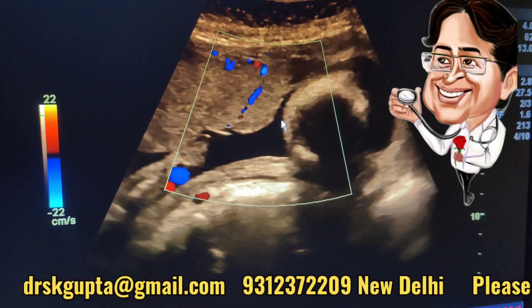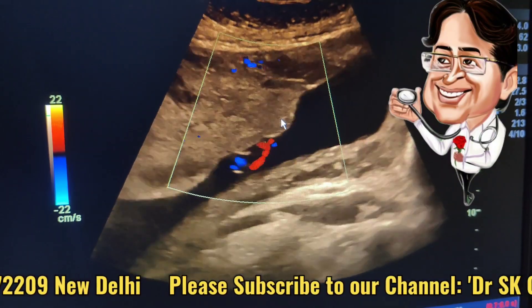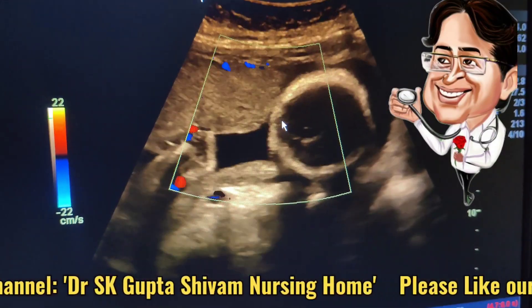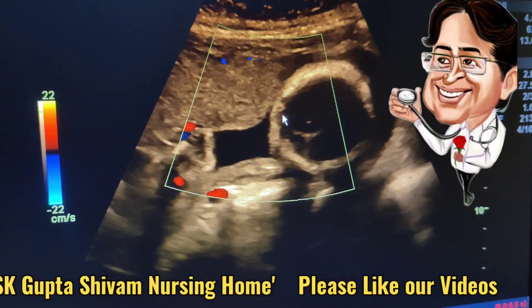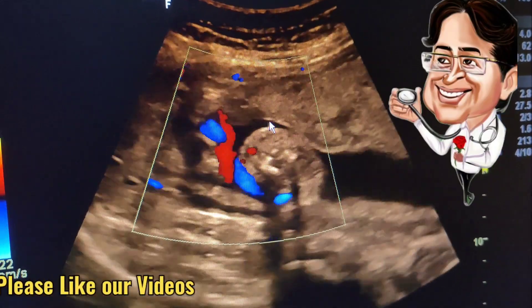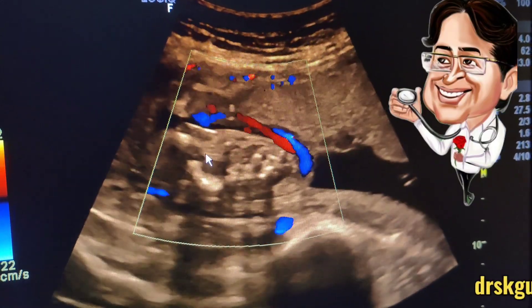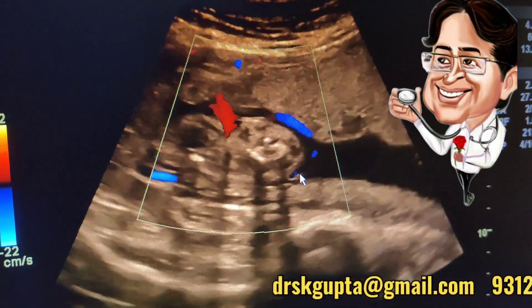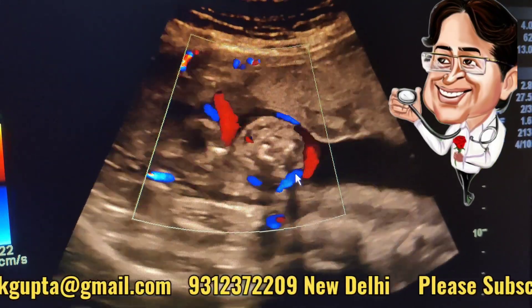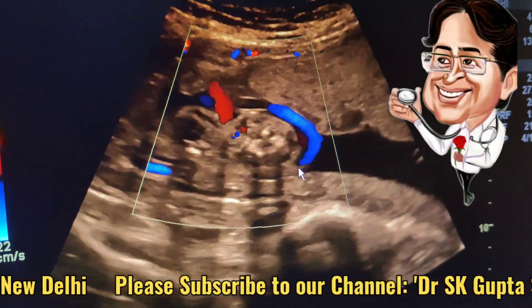If it is attached more than two centimeters from the placental edge, then it is called the lateral insertion of the cord into the placenta. Here you can see that this cord is forming a nuchal cord — a loop of cord encircling the neck of the fetus — and this is a complication of the marginal insertion of the cord into the placenta.